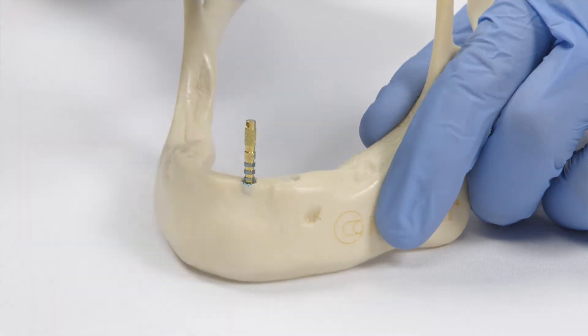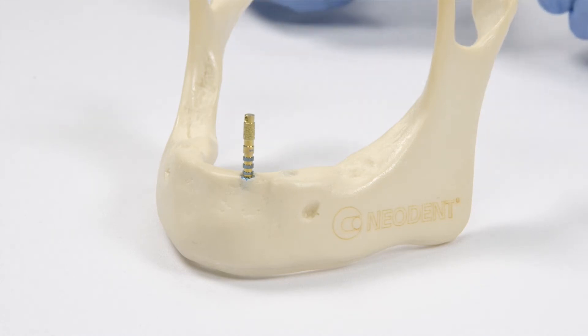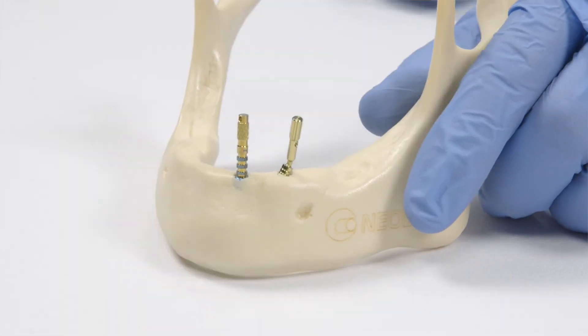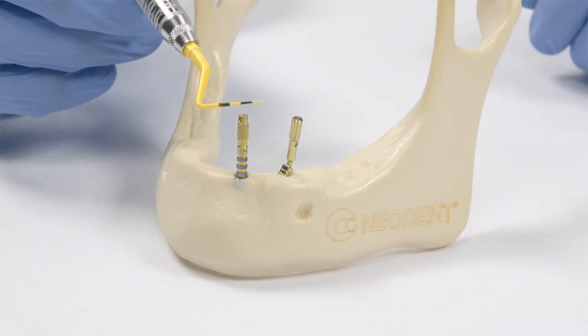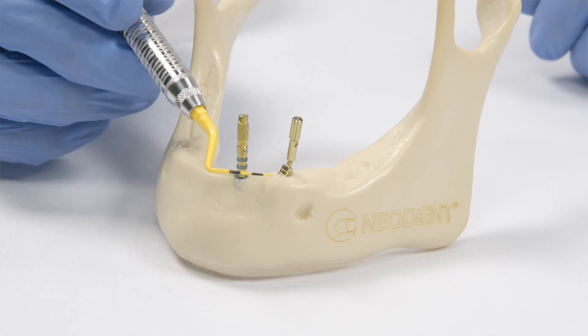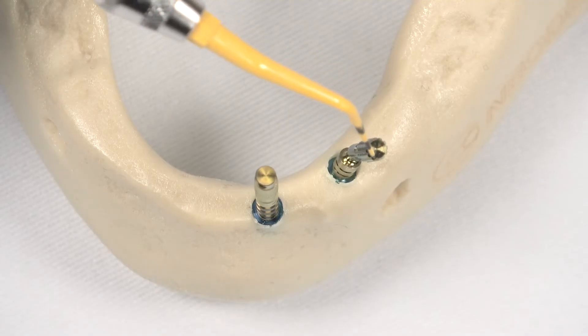This distal implant was placed in a direction close to 30 degrees. So before going in with an angled abutment, here is a try-in abutment with the same 30-degree angulation. They may be parallel, but this angled abutment is a little toward the buccal.